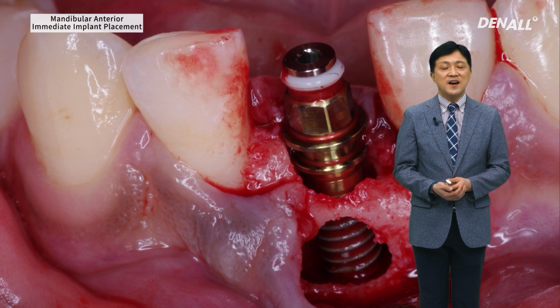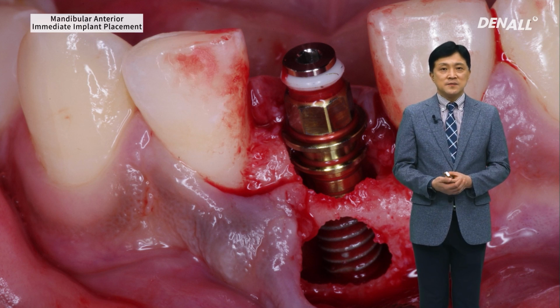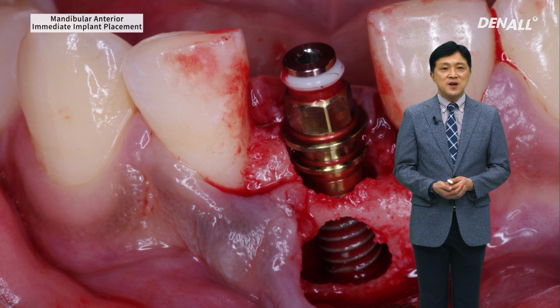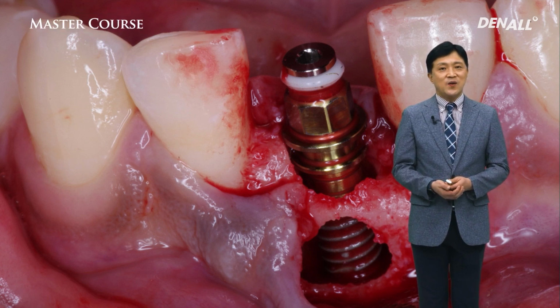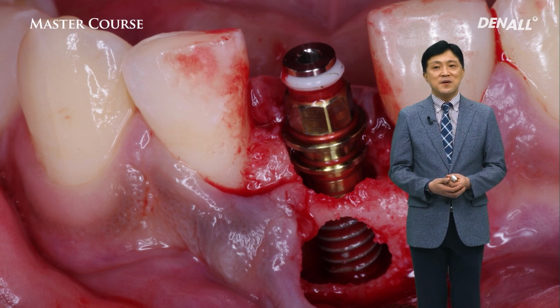Today, I'm going to talk about immediate implant placement in the mandibular anterior region. Placing an implant in the mandibular anterior region is hard for various reasons.